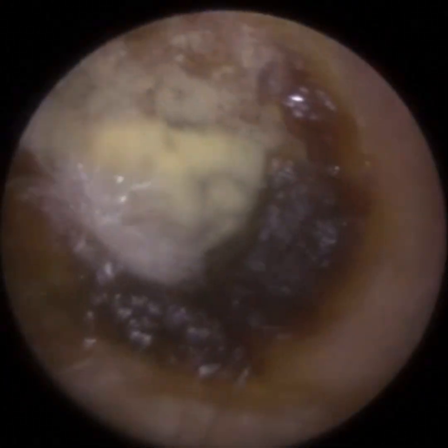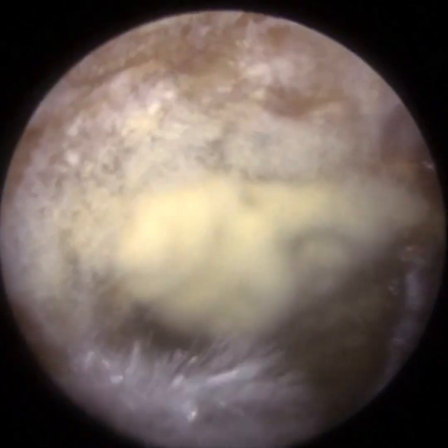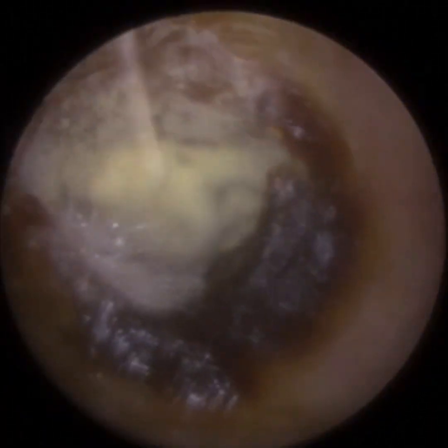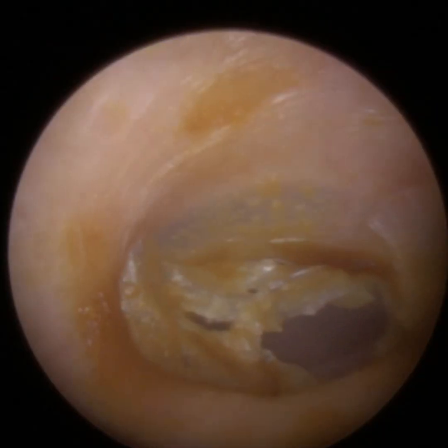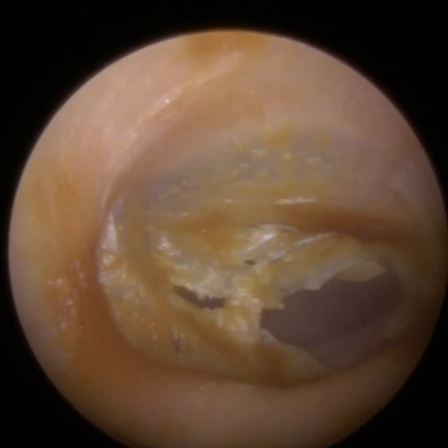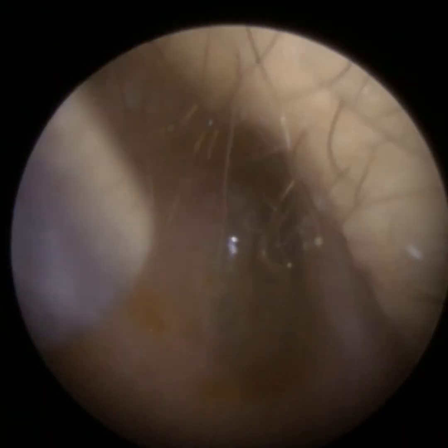It's of a patient who last attended about 6 months ago with a similar issue, and they've returned again yesterday. And this is the left ear that we just looked in, and they've got a fungal ear infection in there called otomycosis. And this is the patient's right ear, and you can see the eardrum's obscured by a layer of thick dead skin. I'm going to start off with the patient's right ear.